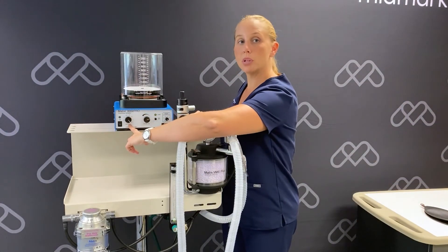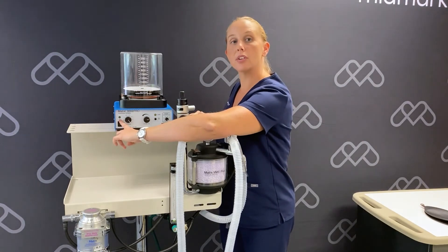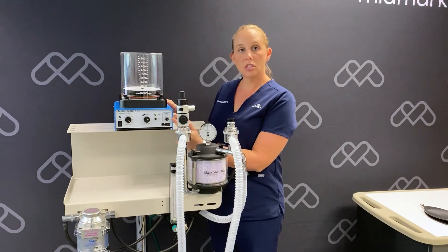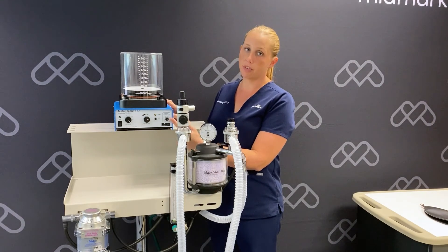Down here we have our power switch. There is a green LED light to indicate when the ventilator is on. Over here we have our maximum working pressure limit control. This is used to set an upper limit for which you wish the airway pressure to never exceed.